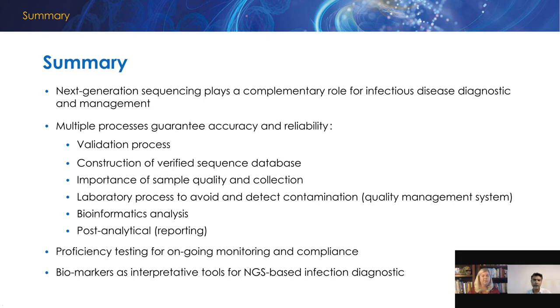Any other formats? Well, ideally, the idea of quality control is that you're trying to be as close as possible to match the specimen that you will be performing. You have a series of positive controls, and some of them are standardized controls, especially those with known concentration, like we described, having high, medium, low concentration for positive quality control material.